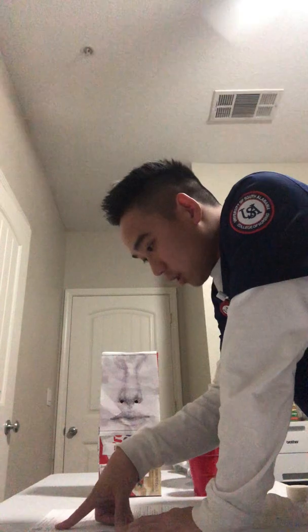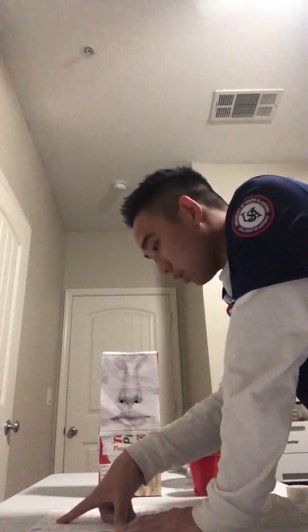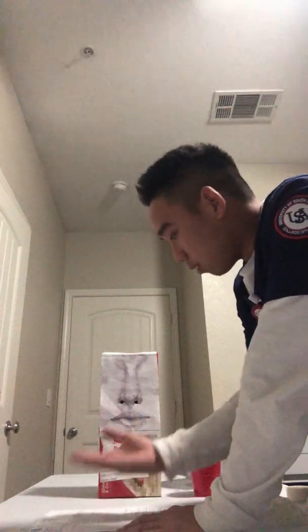So this is Jaguar J. Jones, date of birth 08/25/1963. MR number is 4176352. He's allergic to penicillin. It matches up with the MR and on the wristband, so everything checks out. Then I'm going to explain the procedure to Mr. Jones. So today we will be inserting a nasogastric tube through your nares.